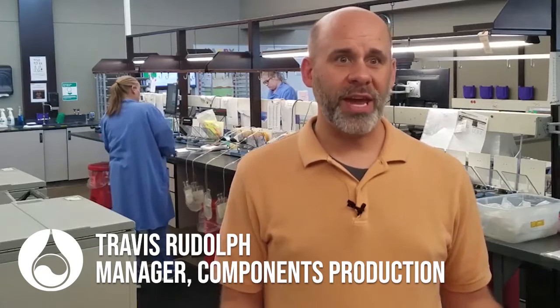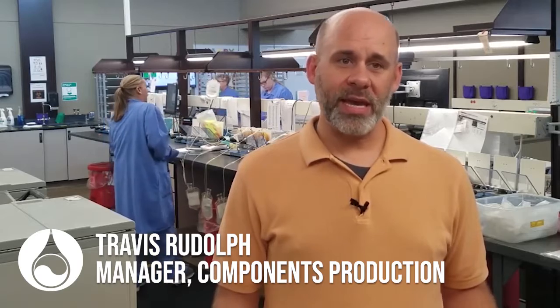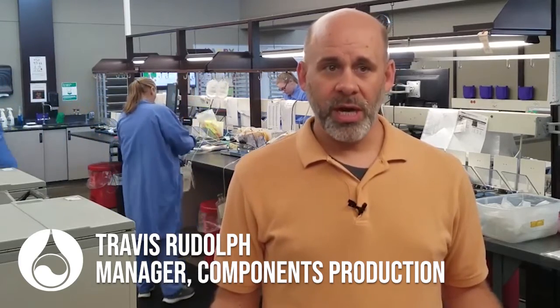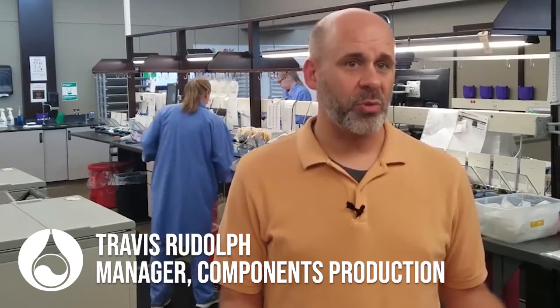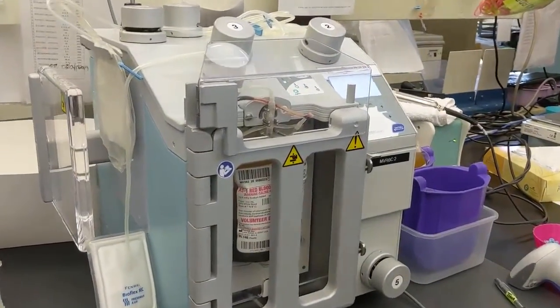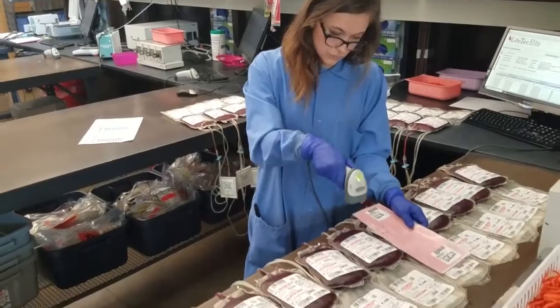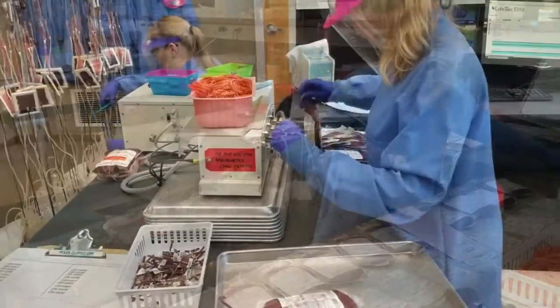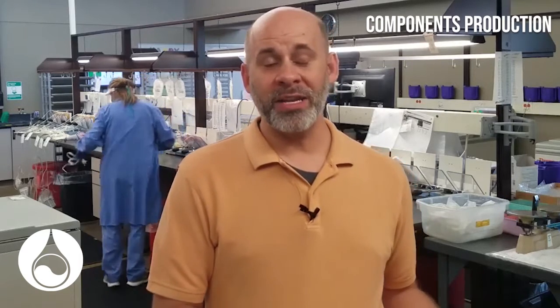Our job is the manufacturing side of production. We take that unit of whole blood and we break it down into its various parts or components, and try to basically use every part that we can to touch as many patients as possible. We're able to make a red cell and a plasma. We can also make a pre-cryo, which is a plasma-based product, and then a whole blood-derived platelet, which is also off the plasma. When you look at components, we are manufacturing. We're the manufacturing wing of the laboratory services. So it's very similar to an assembly line to a certain extent. Our difference is that our commodity is blood.